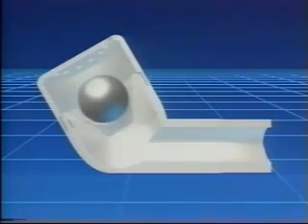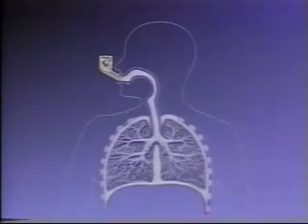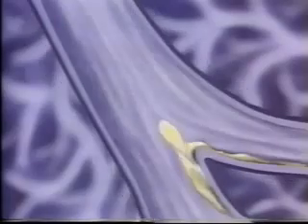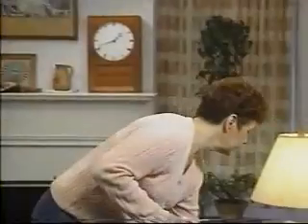This causes airway vibrations that loosen mucus and also causes a slight increase in pressure that aids in keeping your airways open. Mucus is then able to move up the airways to be coughed out. Proper use of your flutter is important for successful therapy. There are different flutter techniques, but the one presented here is used most often.